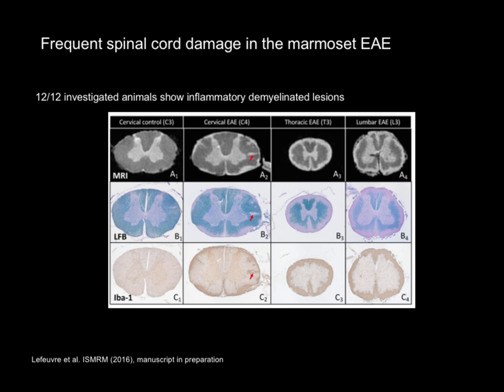Which is currently also a limitation. Human imaging of the spinal cord is very challenging, and having good imaging is always difficult, especially in clinical trials. So this could be, for example, a pre-clinical study where you look at the entire CNS. You can look at the susceptibility of the lesion to repair more or less depending on the location in the CNS by imaging only.